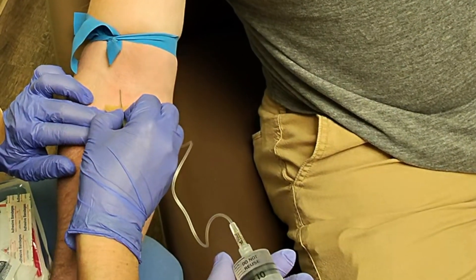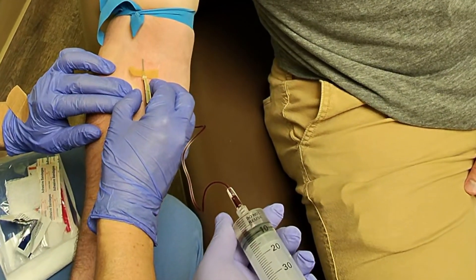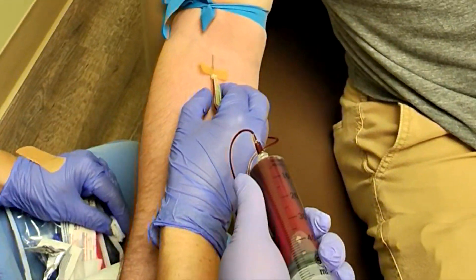A butterfly needle is used to draw 54 cc's of blood from the patient. More blood can be drawn and additional kits can be used in circumstances where higher dose PRP is necessary.